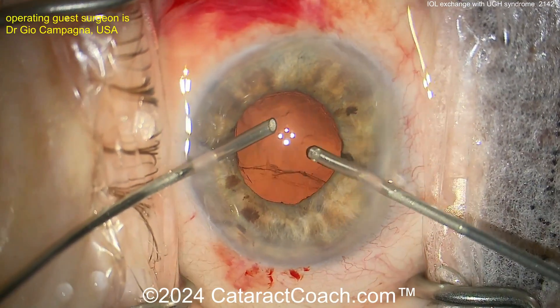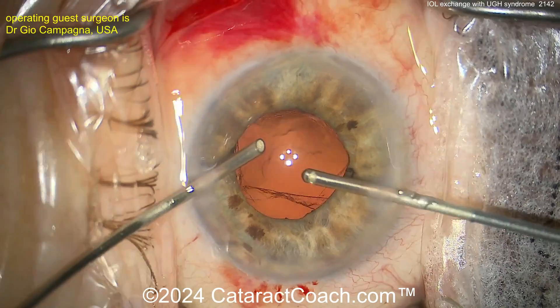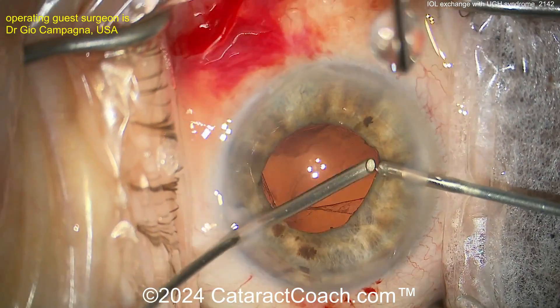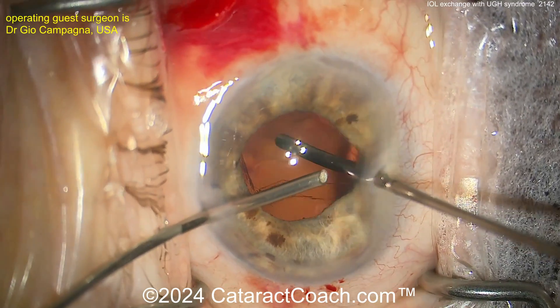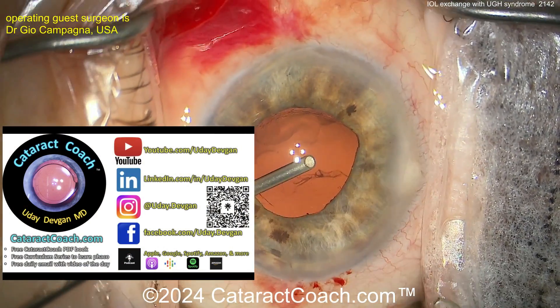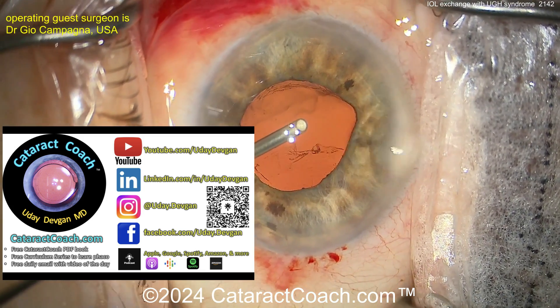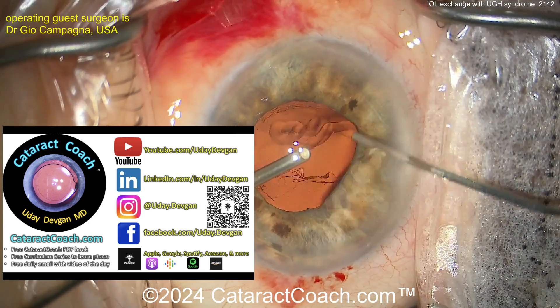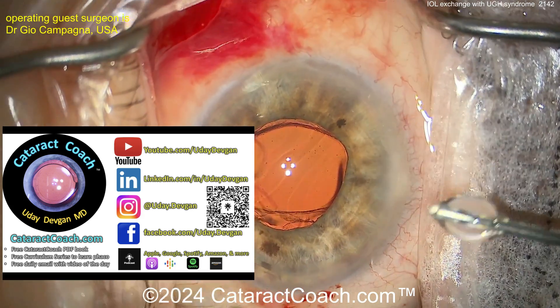The patient had an open posterior capsule — not sure if that's from the original cataract surgery or from a YAG laser capsulotomy done later. Not sure why this lens was in the sulcus. Cleaning up, taking your time — yes, we've sped the video up. Do you know the settings for the vitrectomy? If you go to cataractcoach.com, there's a whole section on how to set up the vitrector, choose appropriate settings, and ensure no more vitreous prolapse.